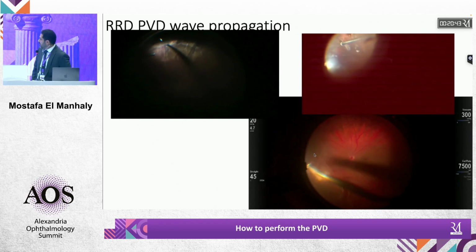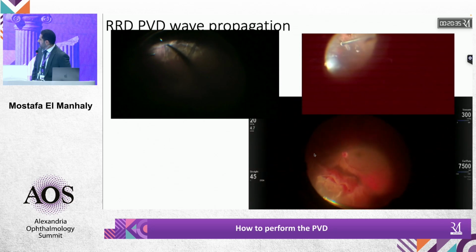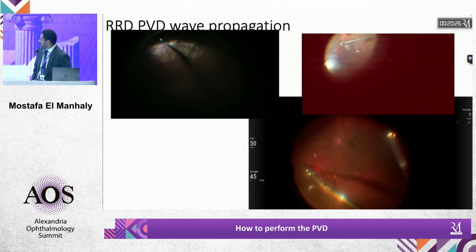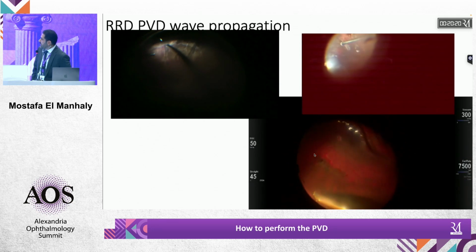However, maybe this is a simpler case. You don't have a high retinal detachment, and you can easily do it. But I will still, in that case, if I have removed the whole vitreous as far anteriorly as I can go, go for air at that stage and just continue anteriorly with the vitrectomy under air. This is my technique. So Dr. Hassan, please.